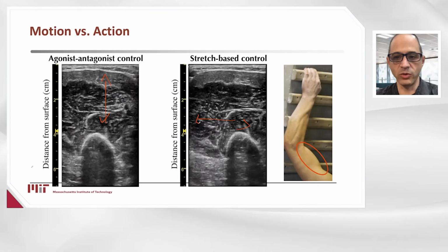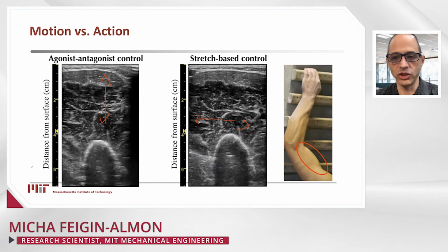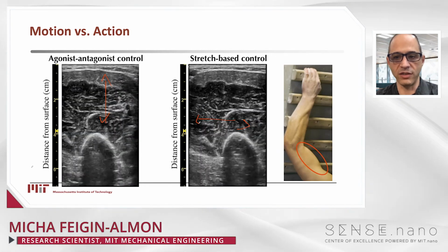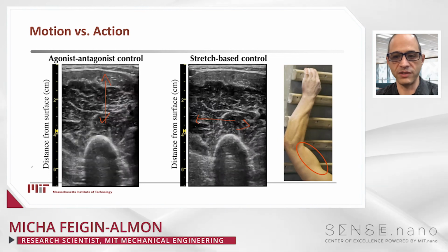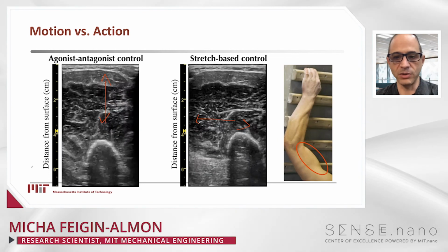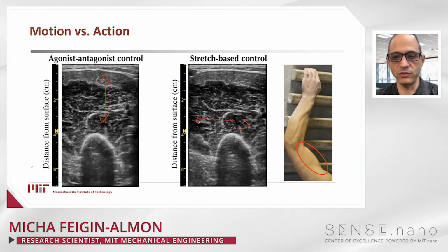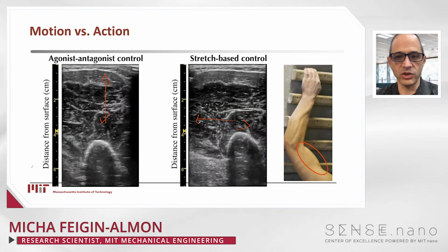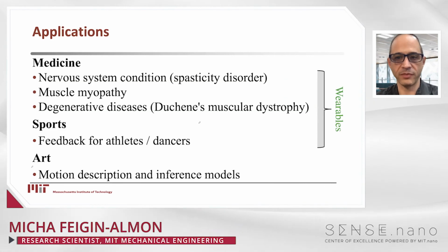While it is true that based on external information regarding the action and load and some assumptions, we can guess that there is a contraction going on in the left image, it is impossible to tell if and how much active work versus passive motion is done and whether any actual action is taking place.